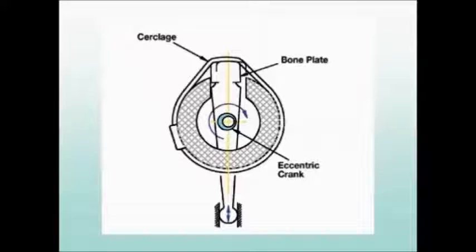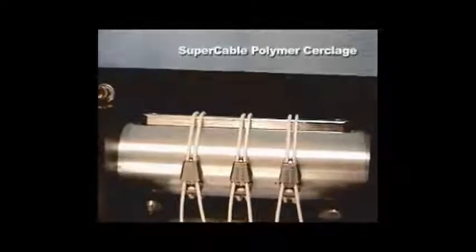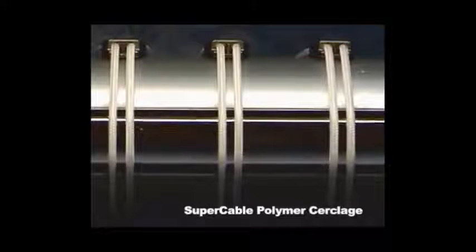This cross-sectional schematic of the test fixture shows the cable wrapped around the fixture and over a movable portion of the fixture, shaped like a standard large bone fracture plate. The cable was tensioned to 100 pounds. The bone plate-shaped member moves in an elliptical orbit under the tensioned cable. The test was run wet to 1 million cycles with no breakage or fraying of the cables.